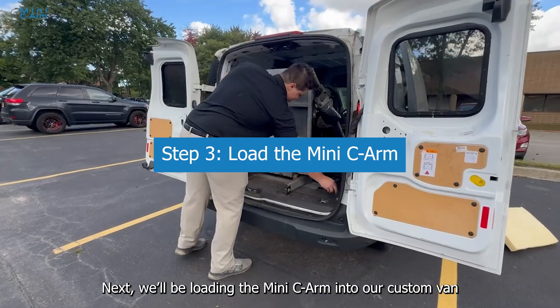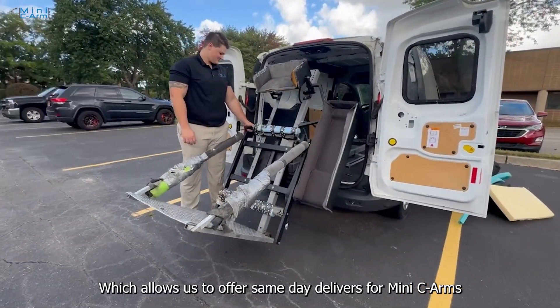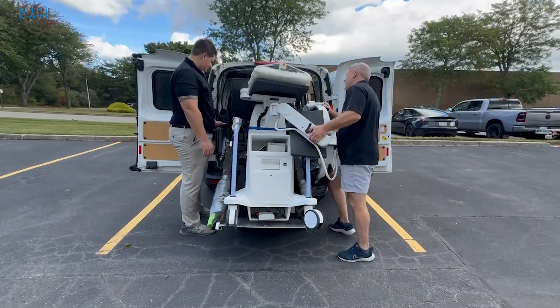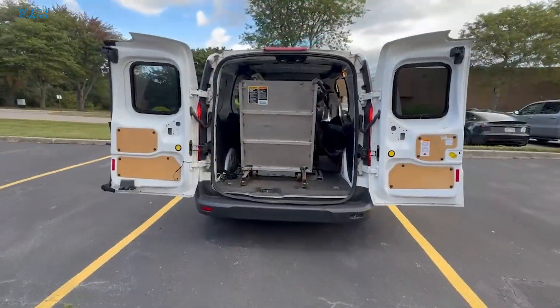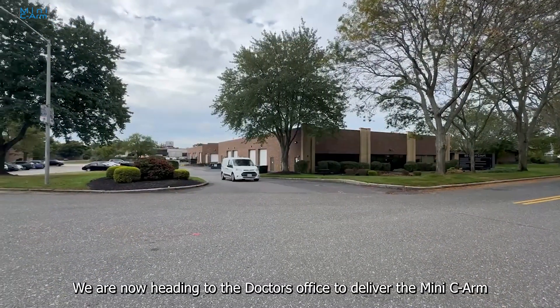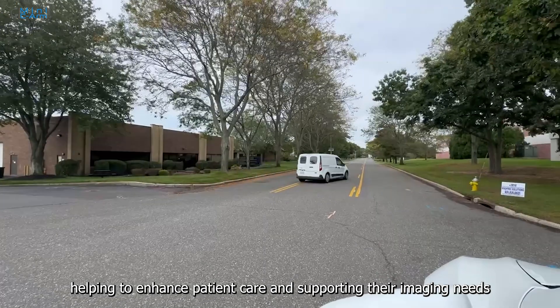Next, we'll be loading the MiniCArm into our custom van, which allows us to offer same-day deliveries for MiniCArms. We are now heading to the doctor's office to deliver the MiniCArm, helping to enhance patient care and supporting their imaging needs.